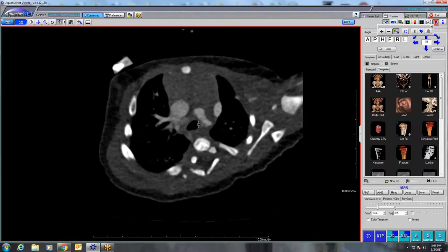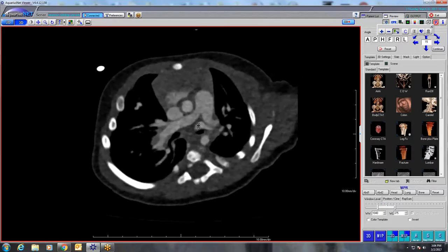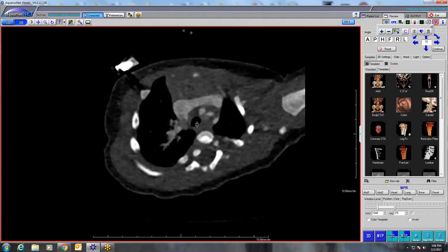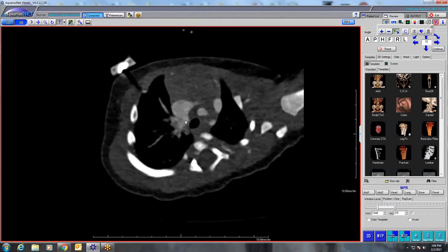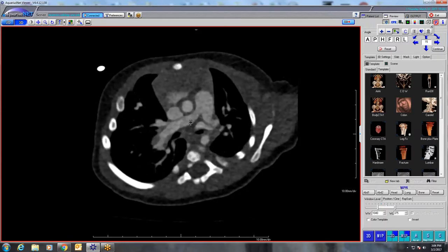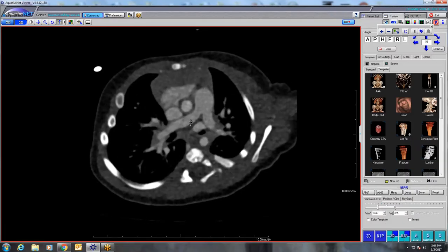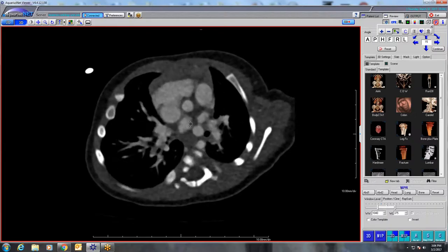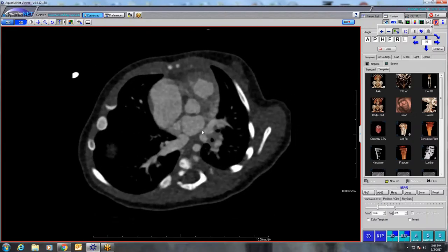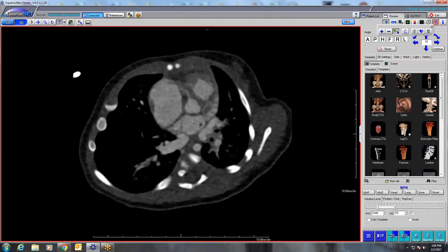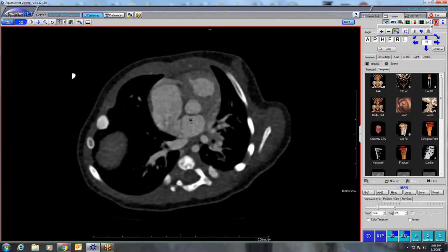Then there's the right superior pulmonary vein, which drains up and then drains into the SVC. So three of the four veins are anomalous and have a shunt — instead of going to the left atrium, they're going back to the right. What's interesting is there's one vein here, quite large. The question is what's this vein doing? It's going into the left atrium.